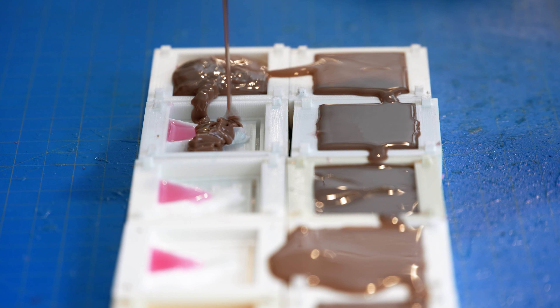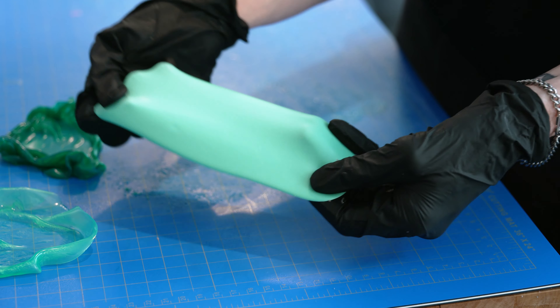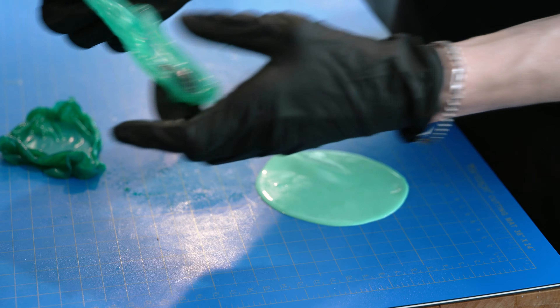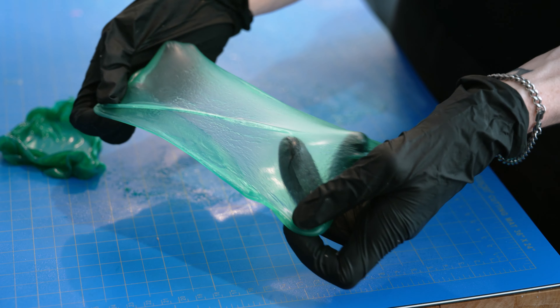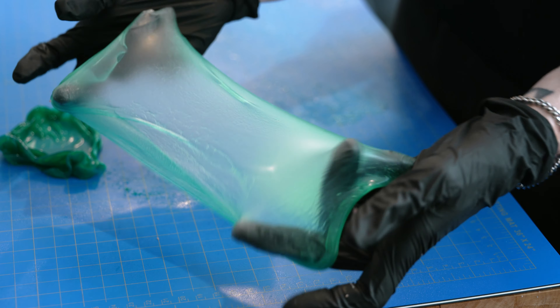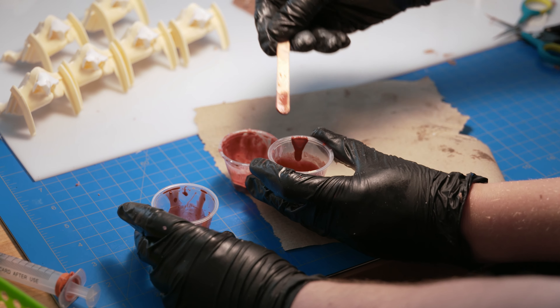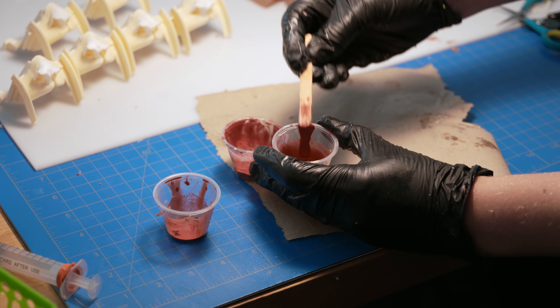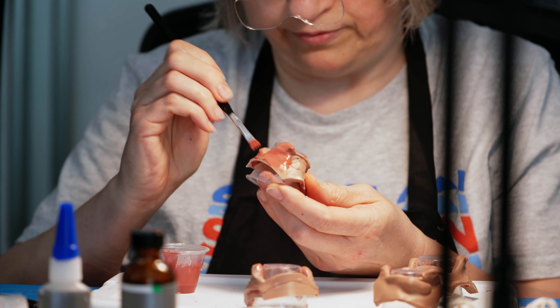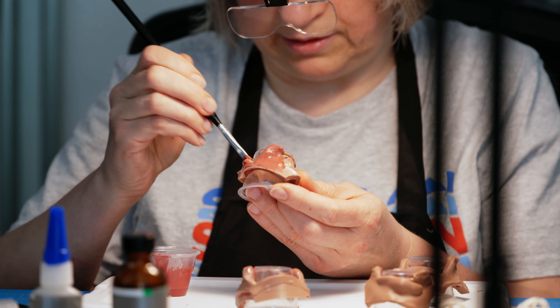We select certain materials based on the tissue we try to replicate. For example, the skin on your cheek would require a silicone with softer properties compared to the cartilage in your ear, which requires harder properties. Mold making involves prepping, injection, curing, and post-processing, with the mold coated in a releasing agent to prevent the silicone from sticking permanently.